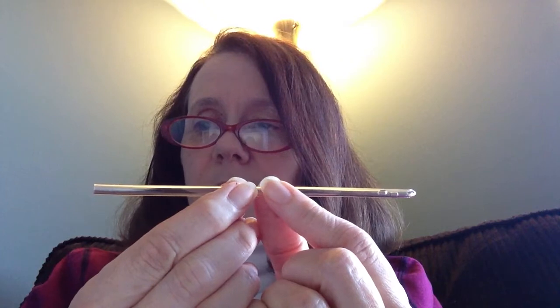catheter. It doesn't have a funnel tip, and again, this is the tip. You want to make sure you get coated in lidocaine gel. If you can't tolerate lidocaine gel, there are sterile lubricants that you can use that would be sufficient for making insertion more comfortable. I like lidocaine gel. I love it, it numbs everything up. I like it going into my urethra. It helps relieve the urethra pain that I already have, makes insertion smooth and simple. It just glides right in place, as well as having some anesthetic effect.